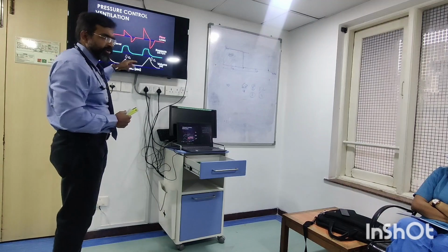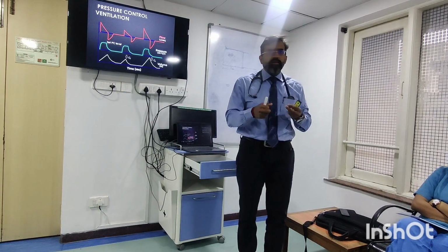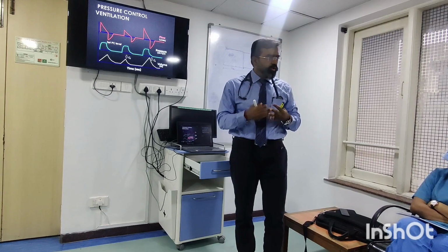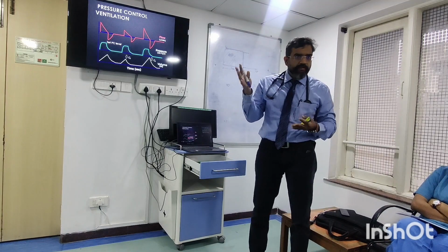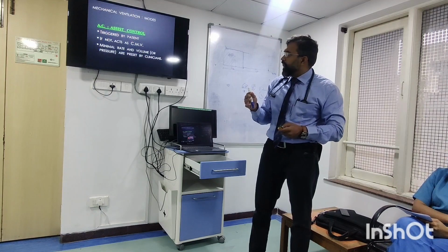Time. Because we set the I:E ratio as 1:2, and we said that at the end of 2 seconds, go into expiration. So that's why the cycling is time cycled. Clear? Simple? As we go, we'll understand.